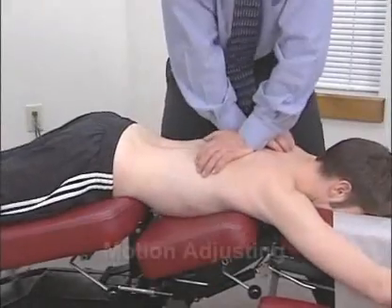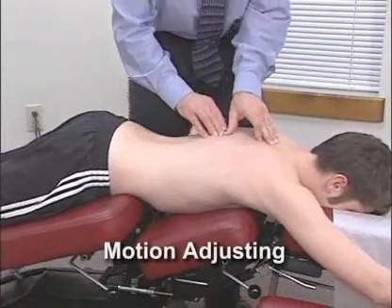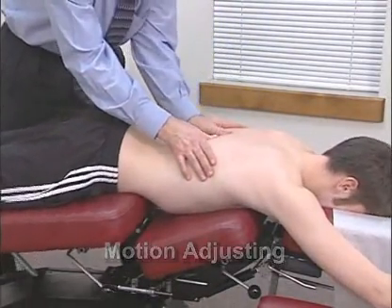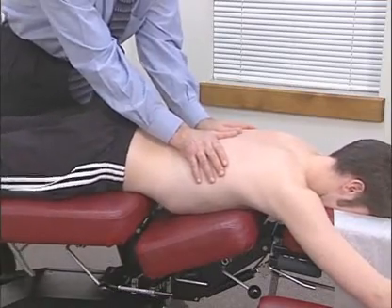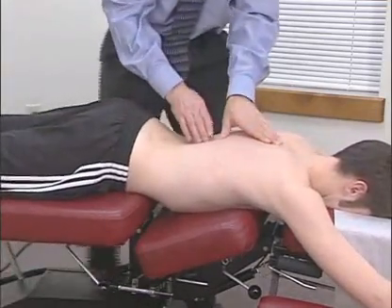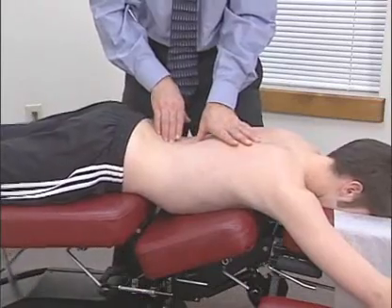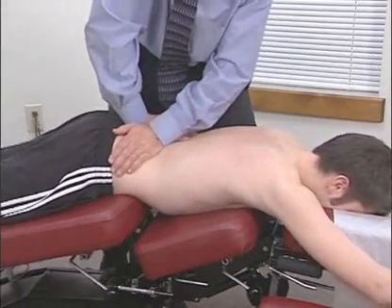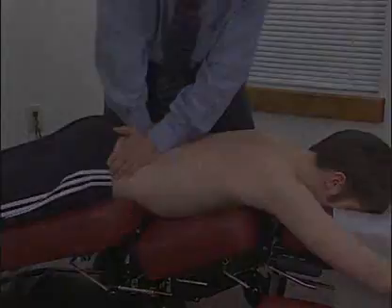Stand close to the table and lean over the patient. A spinal adjustment is only given as the table descends. This procedure is used when adjusting the upper thoracic to lower lumbar spine. Because the joint is in motion, apply less force or thrust. Never apply a corrective force when the table is moving upward to avoid jamming of the facet joints.